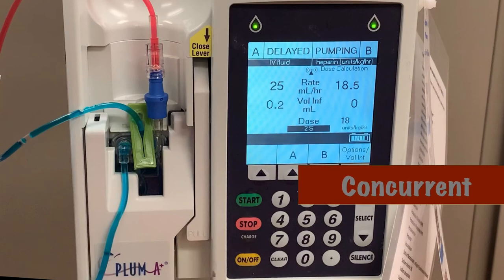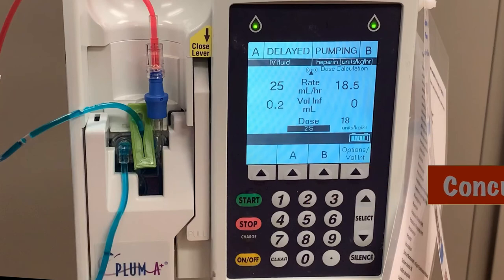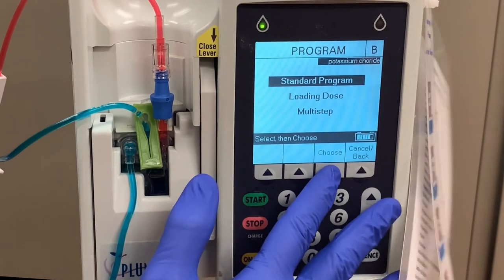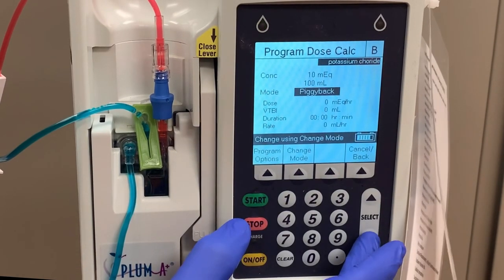There's one other mode we can use to program medications, and that's concurrent mode. For example, let's look at potassium chloride. That's a medication that, when given directly, can cause a lot of irritation and burning in the patient. But when diluted with saline, that burning can be minimized or eliminated. In order to accomplish this, we'll need to be able to run saline through the A line at the same time we're running potassium through the B line. In other words, we need to run these two fluids concurrently.